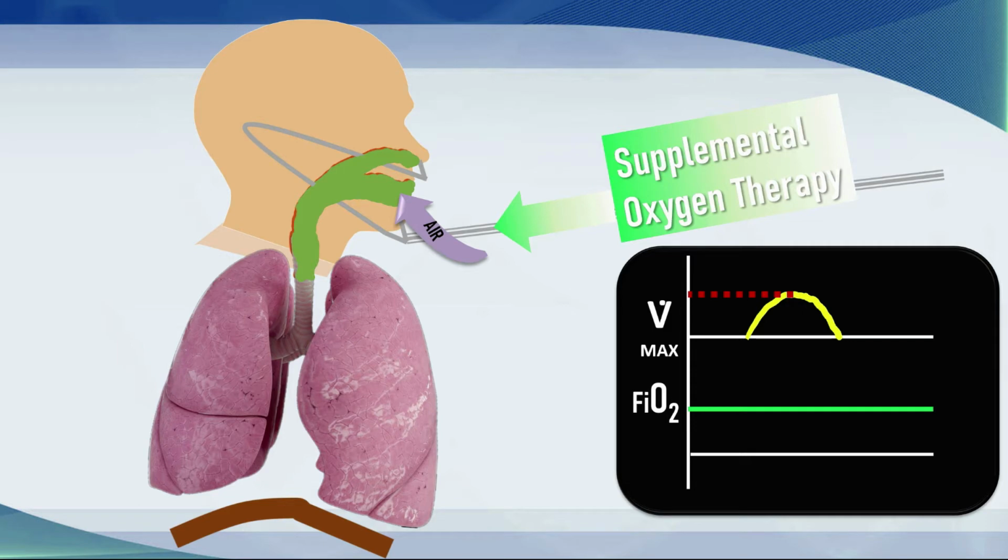So by the time this gas enters the trachea and bronchi, there should be a very predictable inspired oxygen tension. Again, you can see the sinusoidal flow pattern on the cartoon, and the peak flow can be measured. The goal of oxygen therapy is to ensure that the inspired oxygen tension is unchanged during peak inspiratory flow.